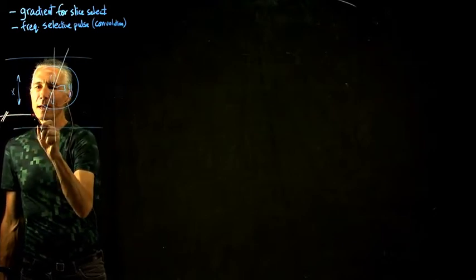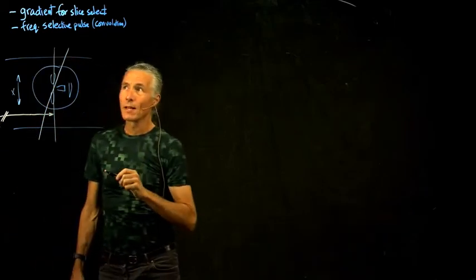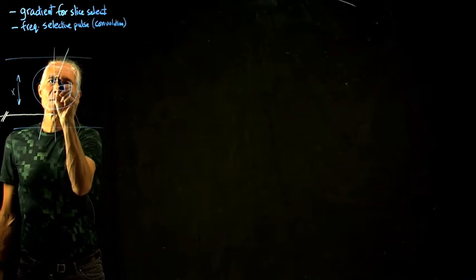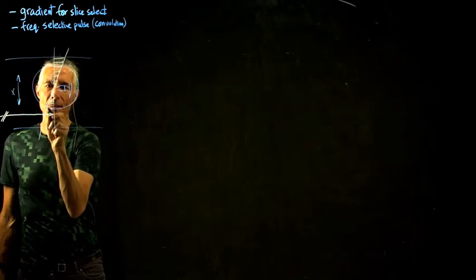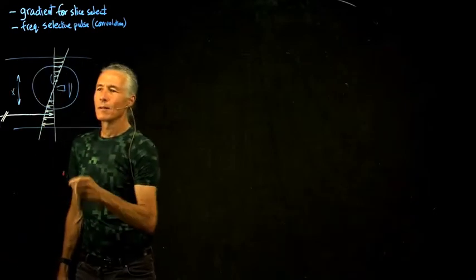We're leaving a lot of it off, but the B field is up to here, everywhere. And so what the gradient does is it just adds a little increment, maybe 1/100th the size of the full B0 field, or subtracts an increment from this B0.